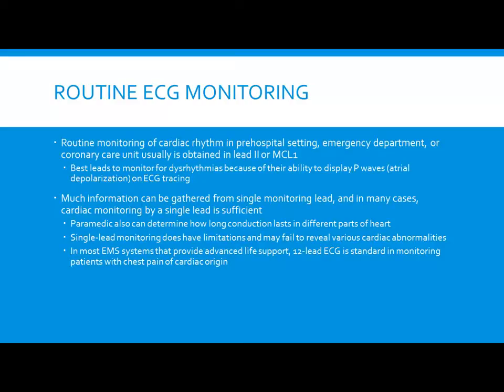When we do routine cardiac monitoring, we're just going to look at lead 2. Routine cardiac monitoring is just going to be placed out of lead 2. If I don't see anything that is cardiac specific, I'm just going to leave it on. I can monitor heart rate on there. I can make sure that the heart's still beating regular and all that, but I don't have to get really in depth with it. So my basic, when I've thrown them on the monitor, just riding to the hospital, lead 2, that's all I got to worry about.